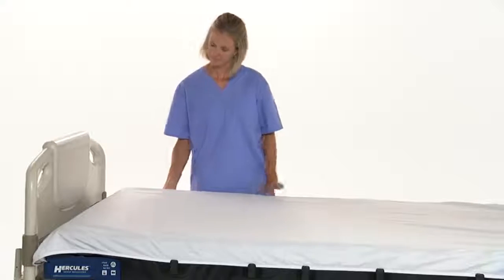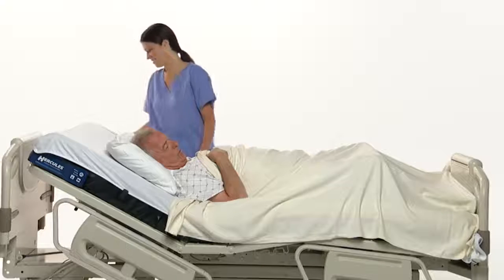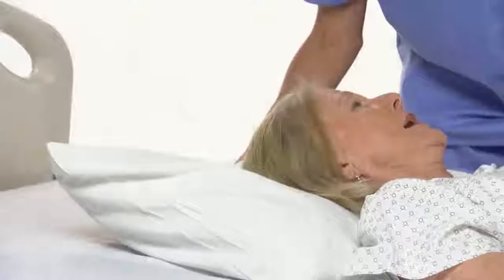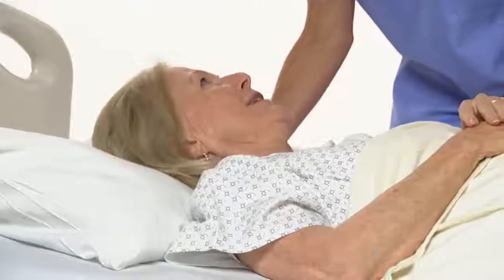Now, when gravity forces a patient into an uncomfortable, at-risk position, Hercules is there to help. With the simple push of a button, a single caregiver can reposition the patient to a comfortable position in a matter of seconds, improving the overall patient experience.